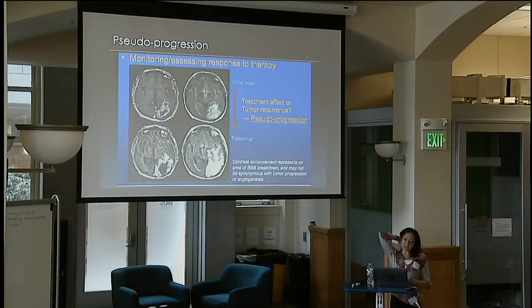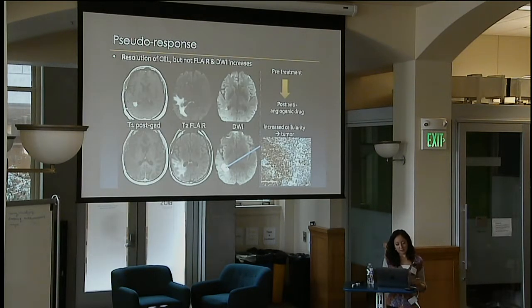data. So moving on to pseudoprogression, in monitoring response after radiation, there's often this increase in your lesion on contrast enhancement, T1 contrast enhancing images, because of the therapy. But this then, if you wait a month or two, this will often resolve. So knowing what's pseudoprogression versus true progression can be important, because you don't want to take someone off a therapy that then would be beneficial to them.